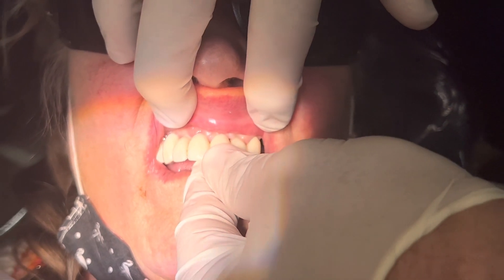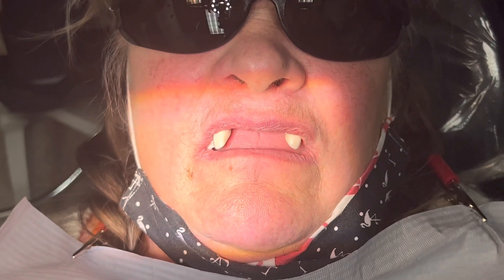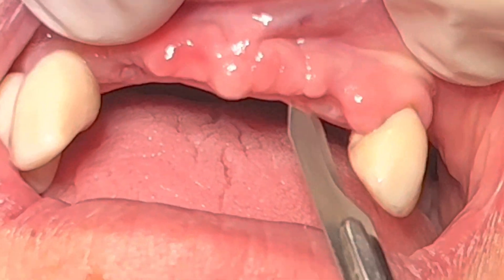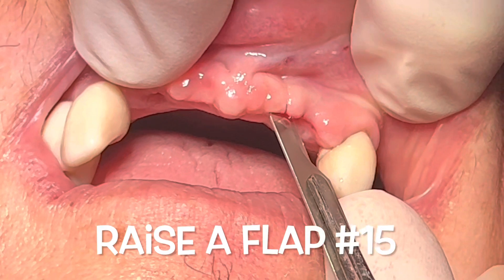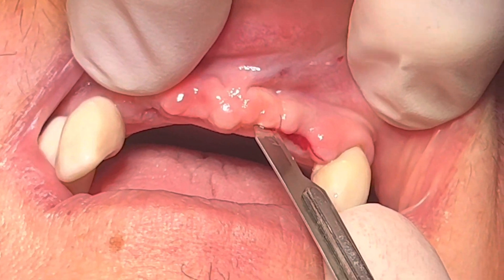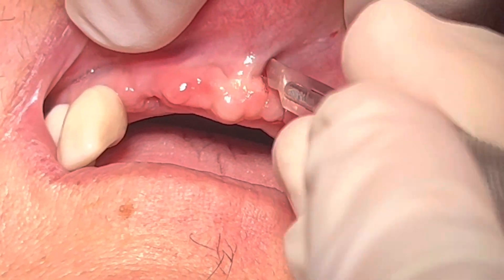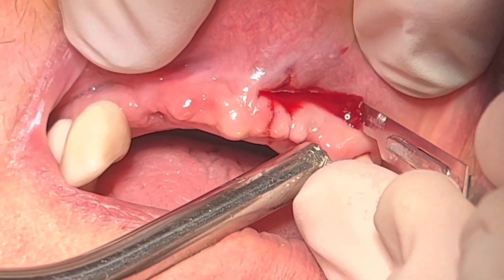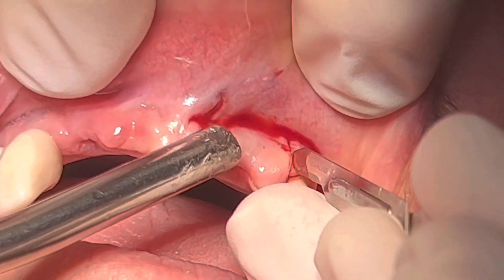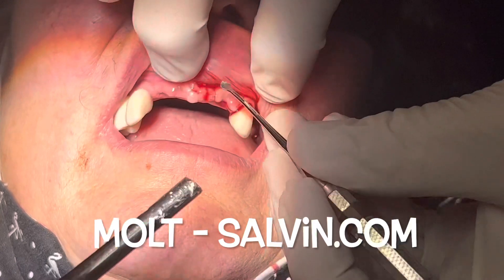I'll take the original bridge and put it on so I can see where I need to do the flap. I'm going to have to do a flap to have a look inside, but I don't want to go too far to the facial or too far to the lingual — just a little bit to the lingual — and then I'll do a releasing incision so I can have a good look and see down into the implant in order to release this screw and get the piece out. So we'll use a molt.